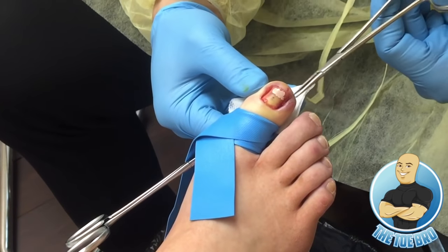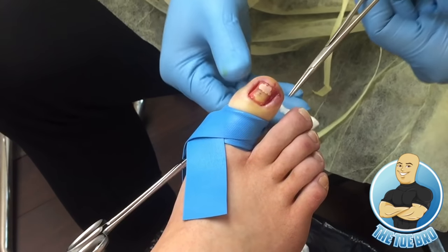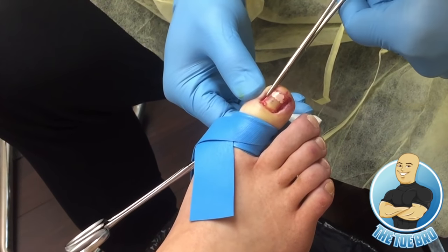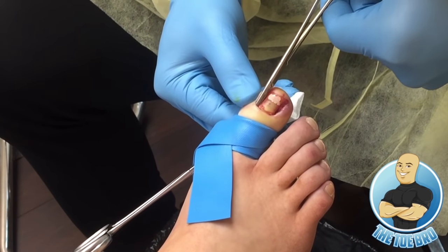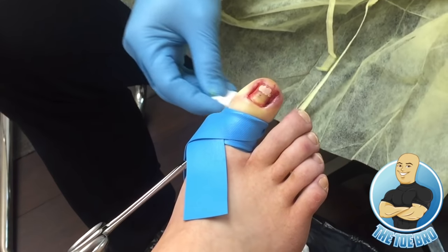So what I'm doing now is I'm using the hemostat to make sure that there's no dead hard skin left behind. It's very common to see a callus buildup on the sides of the ingrown toenails due to all the pressure from the nail against the skin. So by removing this hardened skin, we're going to reduce the chance of any discomfort once the area has healed.